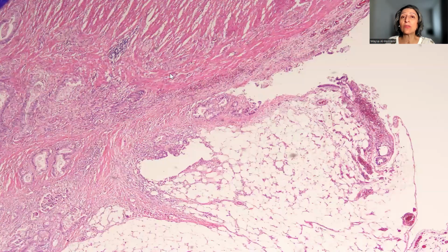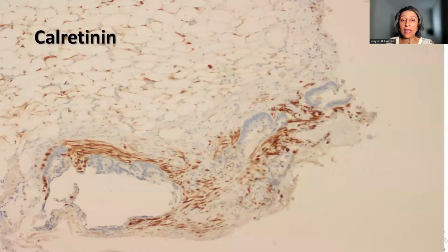How does this really translate in cases? This is a recent case that I encountered, and you can see here the smooth peritonealized surface of the colon, and then suddenly there is this defect, and then here it continues back again to being smooth. Now we can see tumor glands, malignant tumor cells and glands are present here at what appears to be the perforation. How do we prove it if we are in doubt?